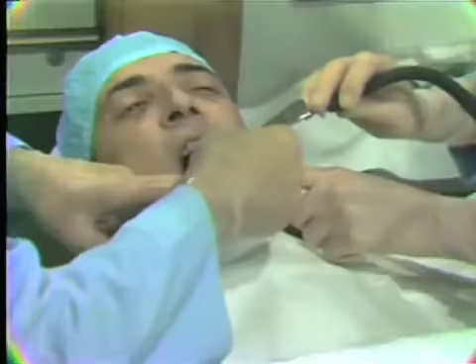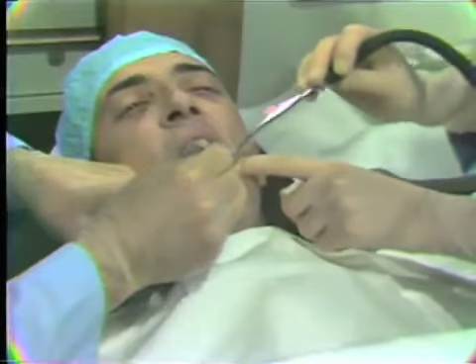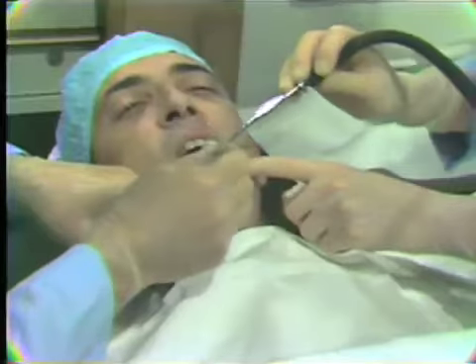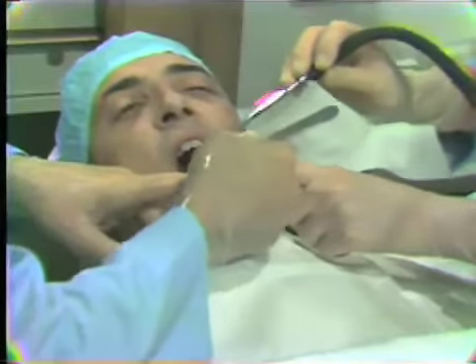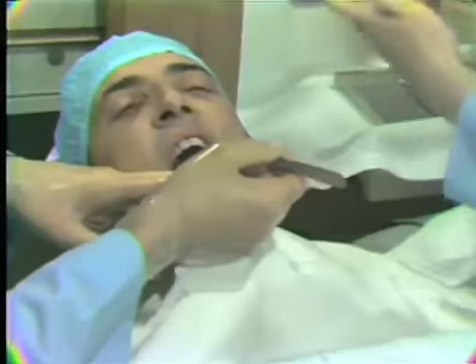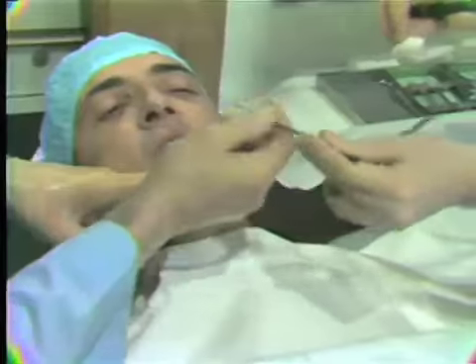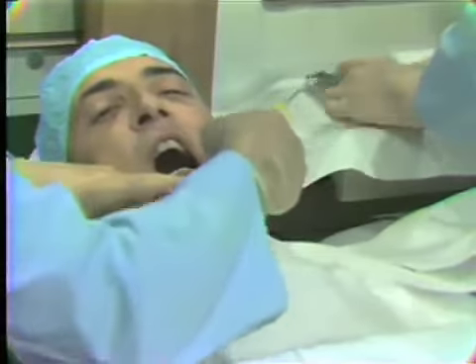And once again, as I complete the intrasulcular incision around the necks of these teeth and prepare for the passage of the scalpel and handle, exchanging for another instrument, we will move then just slightly away from the patient's mouth for the transfer to the number 7 instrument for retraction of the flap.